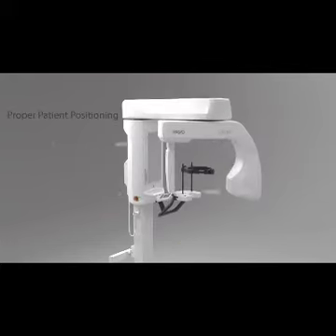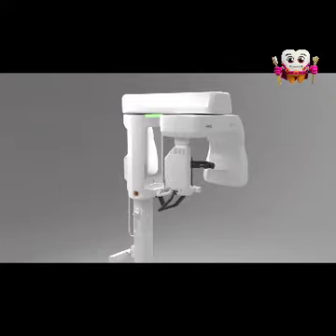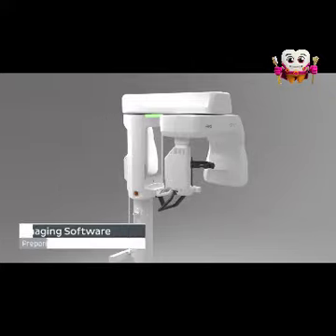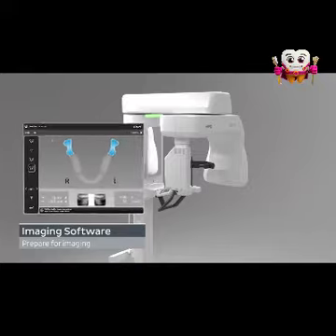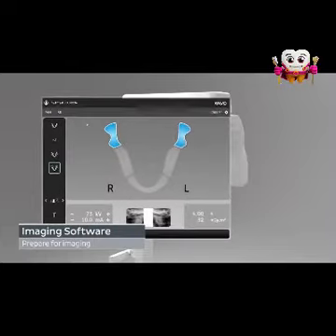for patient positioning, scan size selections, and acquiring an image. Start by opening your dental imaging software. Select the patient for examination and select the device to establish a connection. The device graphical user interface opens on the workstation when the connection to the device has been established.